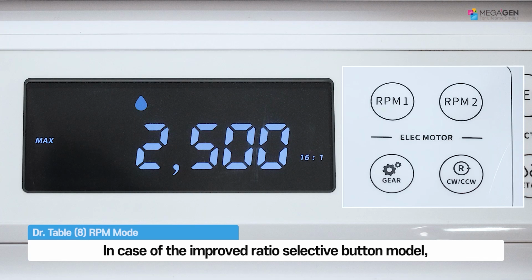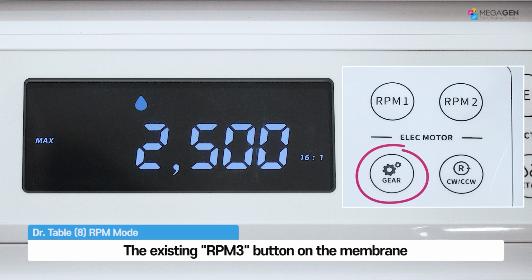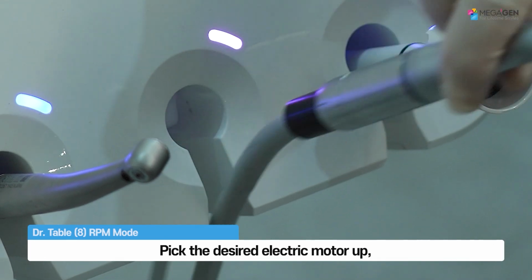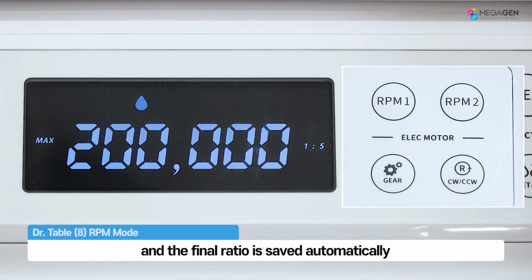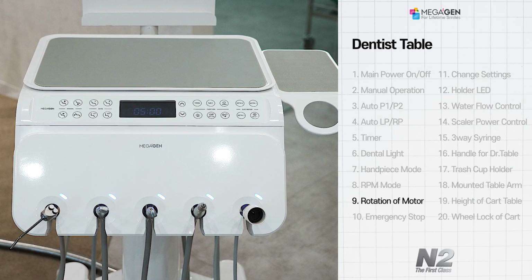In case of the improved ratio selective button model, the method of ratio selection differs from the previous model. The existing RPM 3 button on the membrane is changed to a gear button. Pick the desired electric motor up, press the gear button to change the desired ratio, and the final ratio is saved automatically.